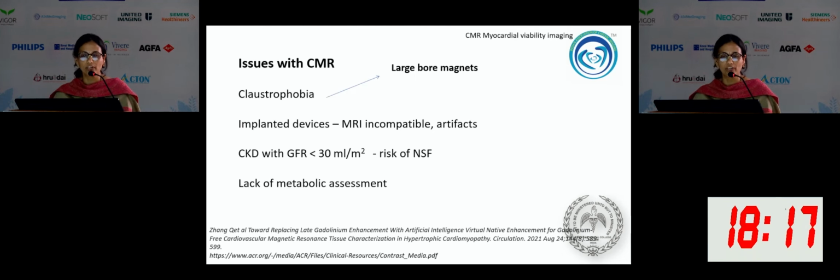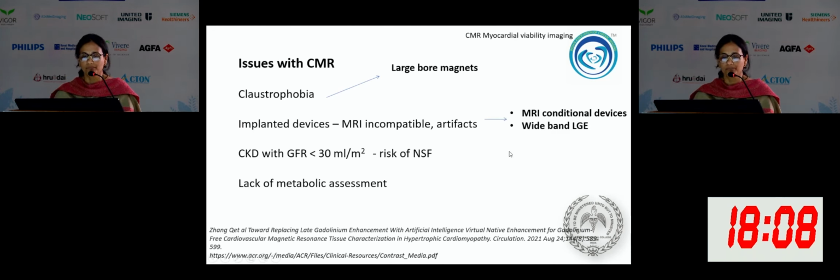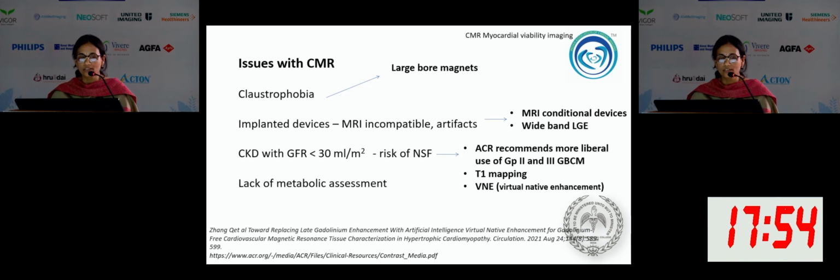Let me say some ways that we can overcome these. We do have large bore magnets, and obviously we can counsel the patients. What about implantable devices? There are more and more MRI conditional, that is compatible, devices coming up, and wideband LGE can be used to overcome the artifacts with pacemakers. What about risk of NSF in CKD? The latest ACR guidelines say we don't have to really worry too much about NSF, especially if we are using the macrocyclic gadolinium contrast agents.